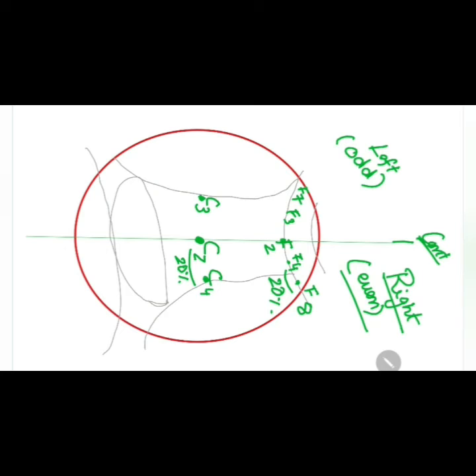So now we are done with two regions, that is front region, then central region. Let's come to parietal, PZ. This should obviously be P4, this should be P3. Right. Now here comes the temporal region, right? So temporal region starting as T3, then T5. Here it should be T4 and T6. See, this distance is 20 percentage, whereas this distance is 10 percentage. That's why here it's 10. And then these are all the basic placements.